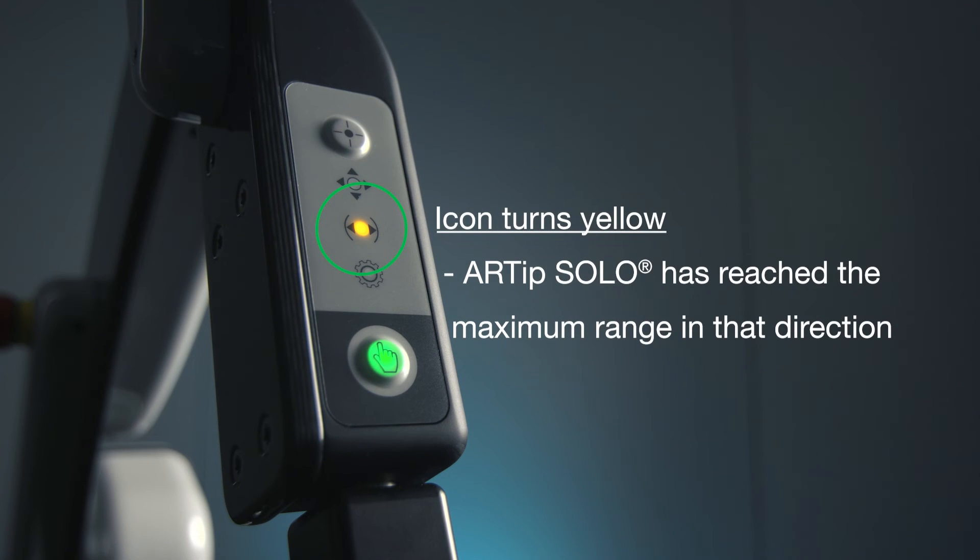This icon turns yellow if the Artip Solo has reached the maximum range in that direction. Any further movement in this direction is no longer possible.